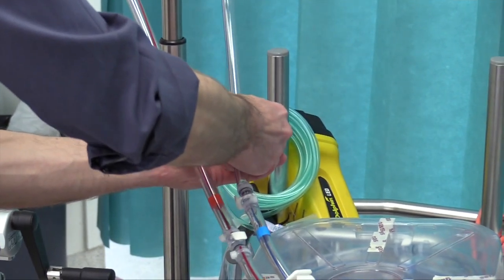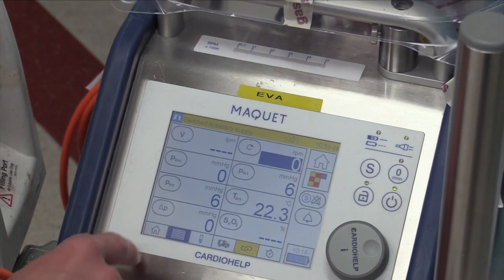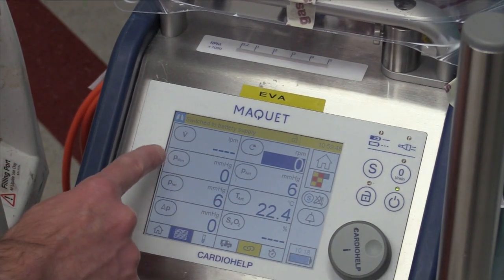Clamp the blue outlet of the priming bag. Now it's time to zero the pressures. Turn the cardio help on and zero the pressures by entering the pressure setting and performing a zero.